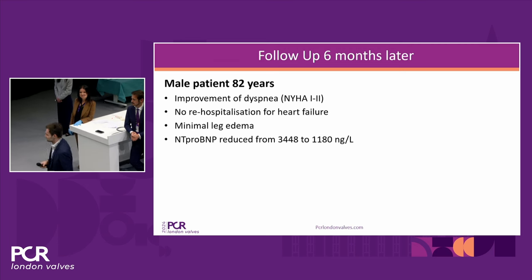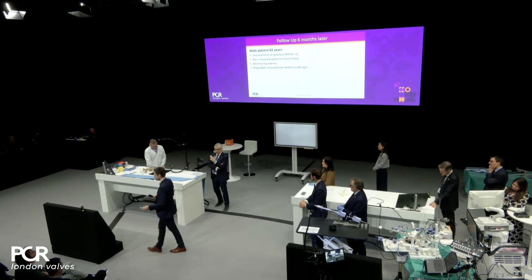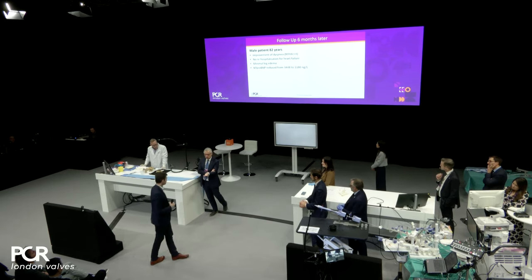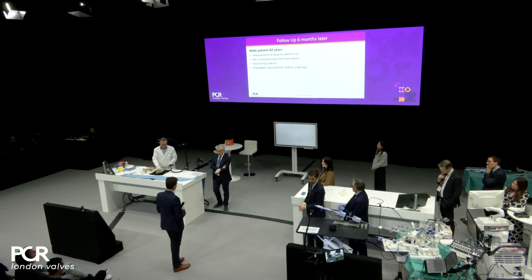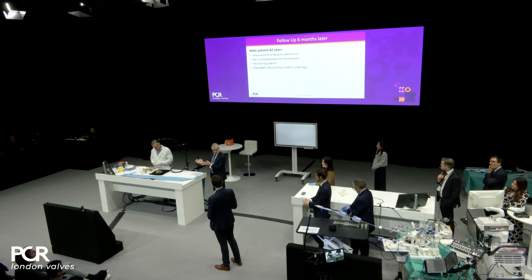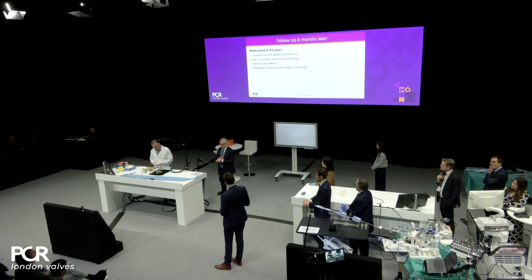Yeah, Thomas, I think you really demonstrated how, for safety, you went in the middle of the valve, easy procedure, reproducible, and you obtained a great reduction of MR. Still a little bit of MR coming from the cleft, you know? That is exactly where it comes from.